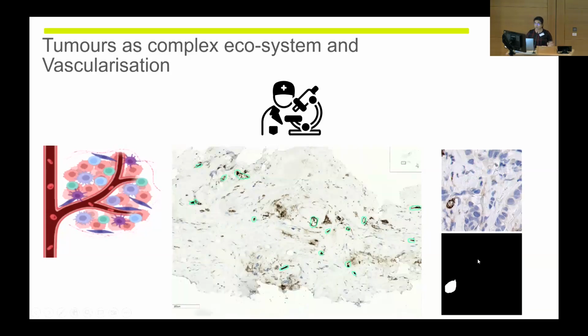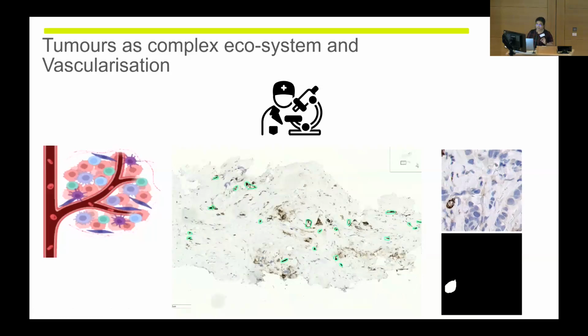As the previous speaker also mentioned, whenever you are collecting the pool of data, you cannot directly patch it and pass it to your deep learning model. You have to select the positive representation and feed the data with it. If you have like 90% negative data, which is the empty tiles, then it could overtrain, and your segmentation output is not going to be well represented in your training data. So you have to always be thinking about model overfitting because of the negative representation that you have given.